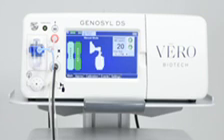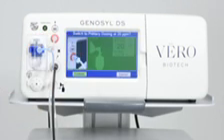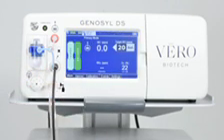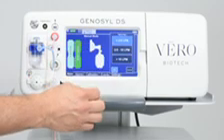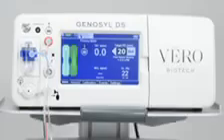To return to primary mode once manual ventilation is complete, select Switch to Primary. Follow the on-screen prompts and then press Confirm. If the adaptive sensor is not connected, select Switch to Primary and select the total flow range on the user interface that correlates with the flow of the patient's gas delivery system. Press OK and then press Confirm. The NO dose that was used during manual ventilation will carry over to primary automatically.